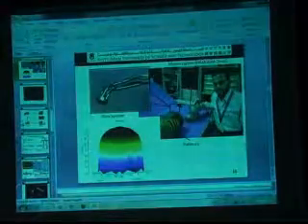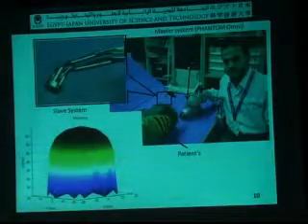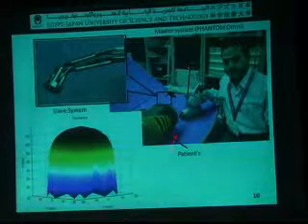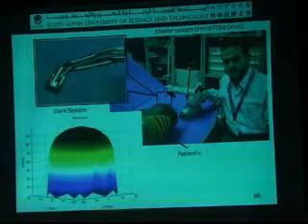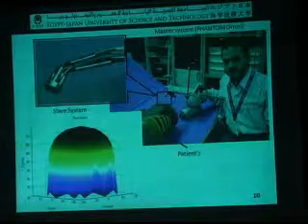So, a very nice result of this robot: it has 6 degrees of freedom and a big working space. The control is easy and cheap. Maybe $10,000 you can make such a machine. And also, the control or master unit is very cheap, with any joystick.